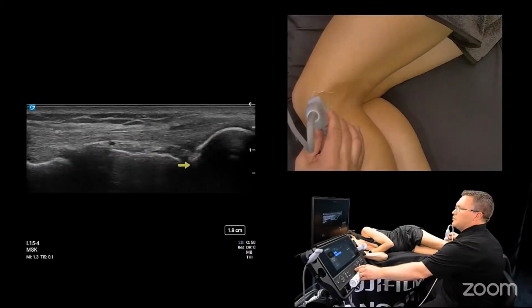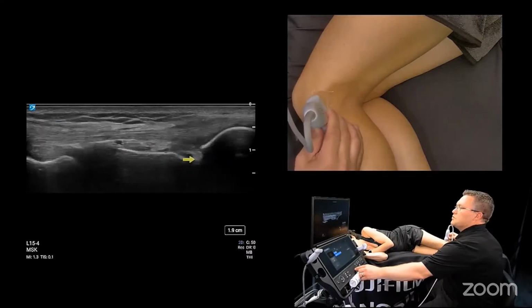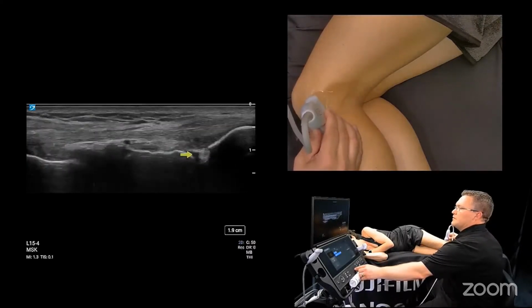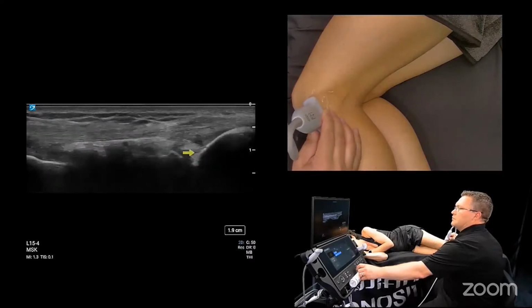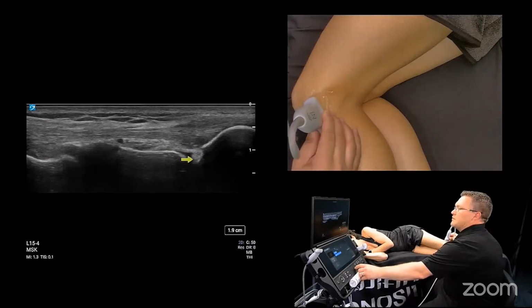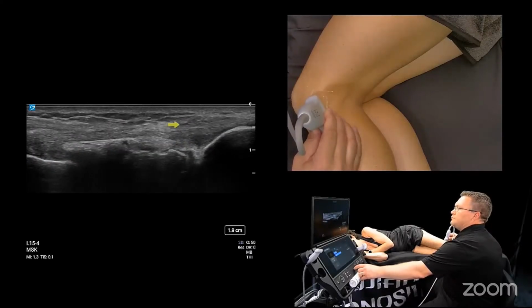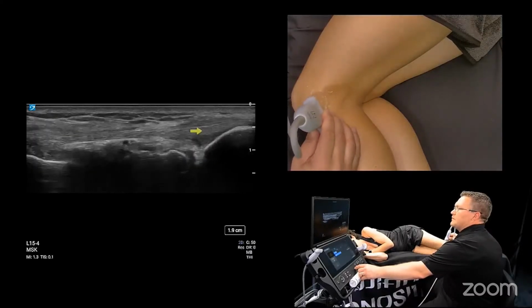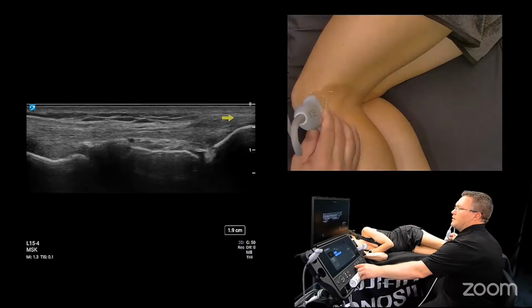We have the joint between the fibular head and the tibia, which some bursal effusions, joint effusions, and ganglions can come out of, and also a neuroma can live here. So be aware of any soft tissue masses that arise out of this joint. Then we have, superficial to the LCL fibers, look up here. Everybody see this oval right there?